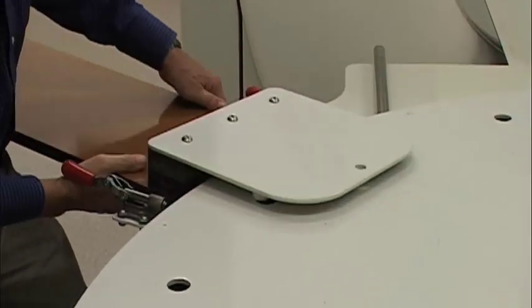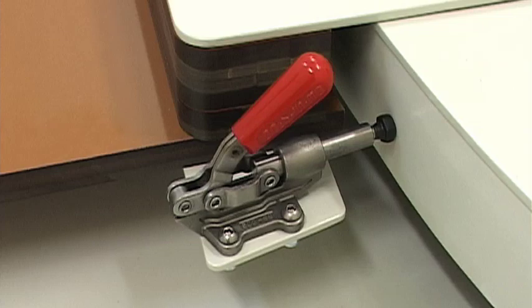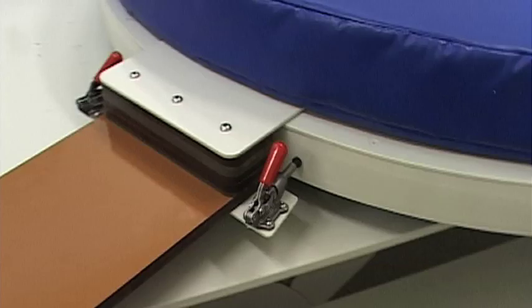Attaching the supports to the carousel is a simple procedure. A unique locking system ensures the supports are securely attached.